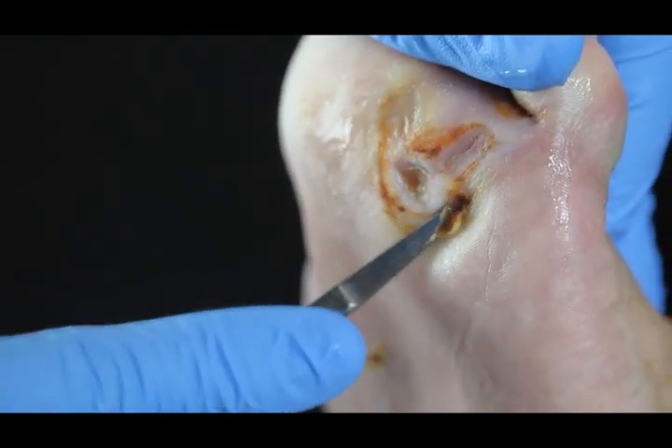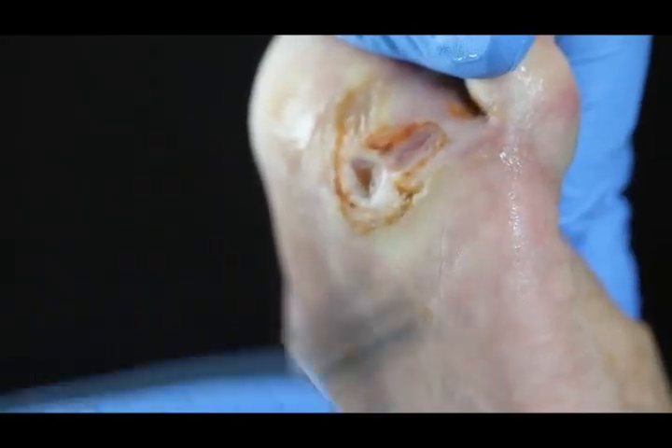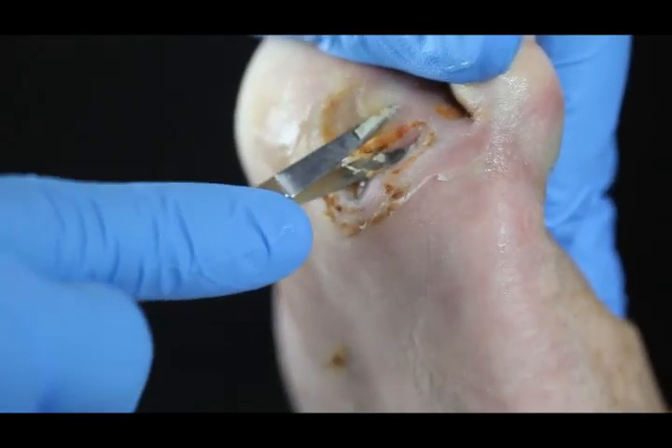This is Dr. Randy Wolcott, and this is a diabetic foot ulcer — one of the more common wounds we deal with in wound care. The question always comes up: how much do you take off? That's what we're going to try to answer in this video.